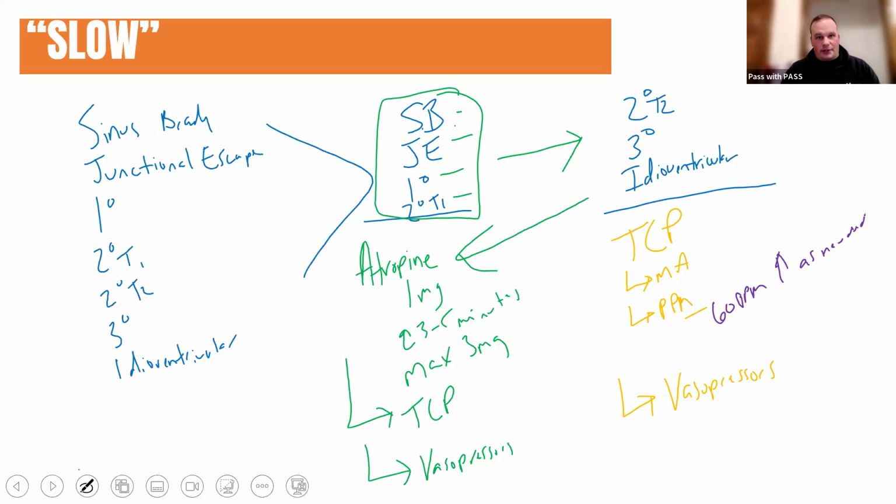Now, what I would personally tell you if I was your paramedic instructor is I would personally start that patient off at around 70, maybe 80 paces per minute, because I'd like to get them a little bit higher than that threshold of being bradycardic. So 60 is fine. It's better than where they're at, right? If they're in this algorithm to begin with, but I just personally like to see them beating a little bit faster than 60. Let's try to get them around 70 paces per minute and see if we get their blood pressure up. Let's see if we fix their dizziness, right? Or their chest pain or whatever their symptoms are for us to be treating them in the first place. So AHA does give some definitive recommendation there of that 60 paces per minute.